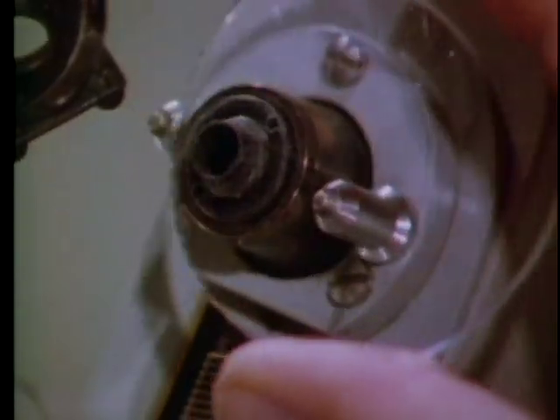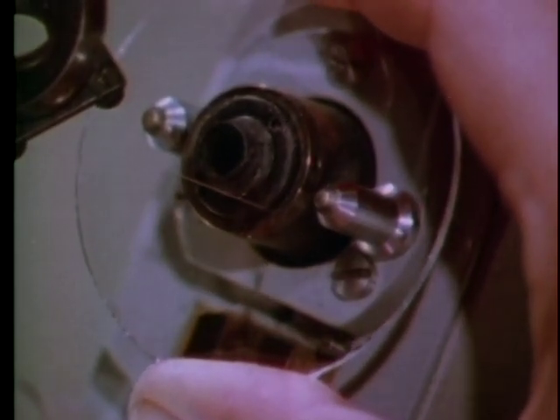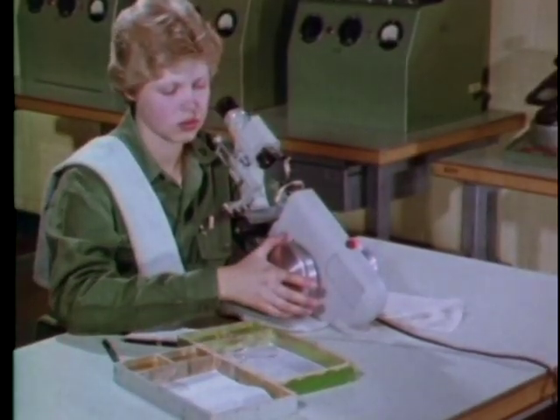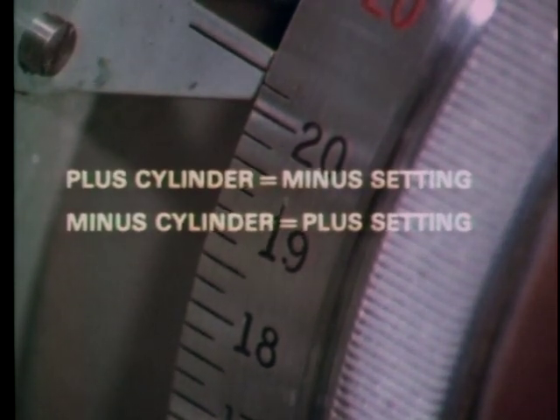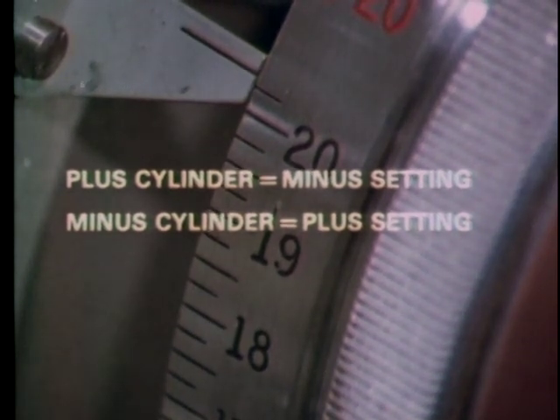The next lens is a bifocal, mounted with the bifocal segment at the bottom and below the lens tube, so you are looking through the lens itself, not the segment. Convex side is toward you as usual. With bifocals, you always work in minus cylinder form, so you start with the power wheel turned to the full plus setting — think opposites: minus cylinder uses a plus setting.